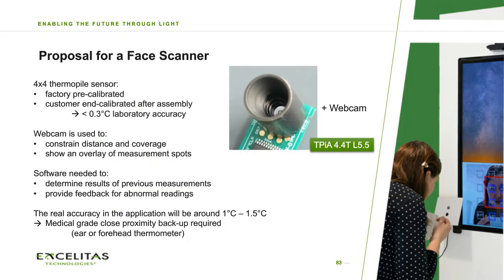So this is why our proposal for a fever scanner, which you can produce in big quantities, would be something like this one, where you simply take a 4x4 thermopile sensor, which is factory pre-calibrated. However, if you want to have medical accuracy written on your final device, then you need to recalibrate it.